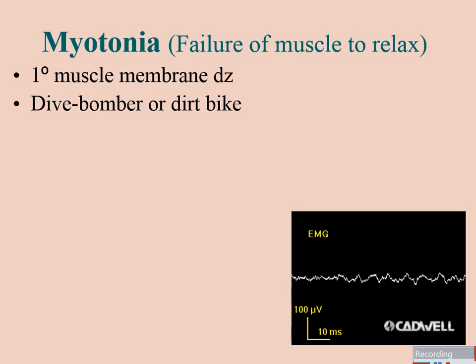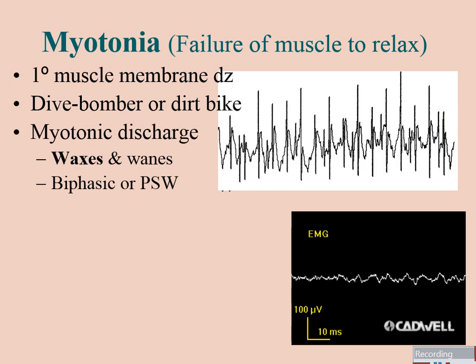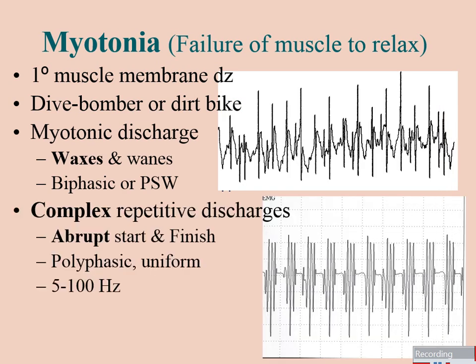And that's one of the other things that we listen for when we're recording these: what is the offset like? So our needle probably gets these things going. It's probably a very prolonged insertional activity, because these will go on for 30 seconds, a minute or so. And you get these kind of polyphasic waves. Some of them can be very rhythmic and have a very musical sound to them.